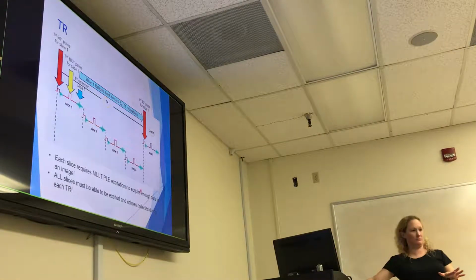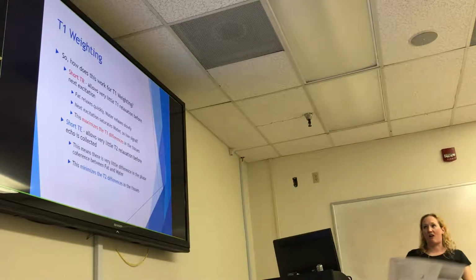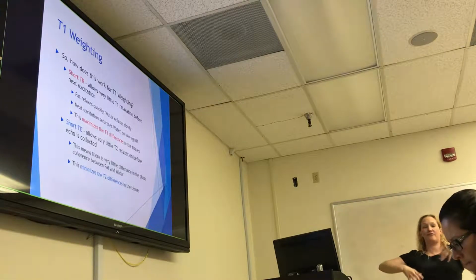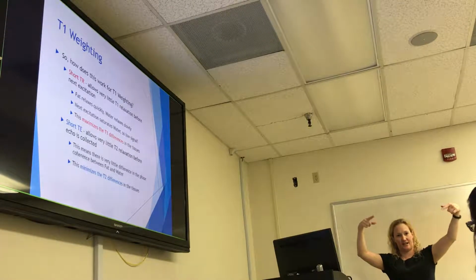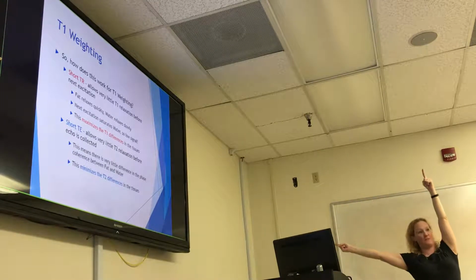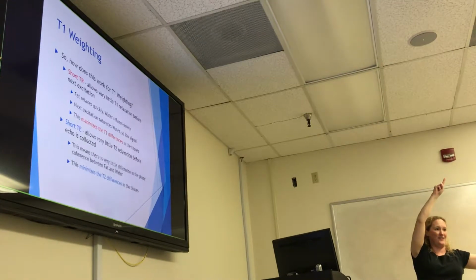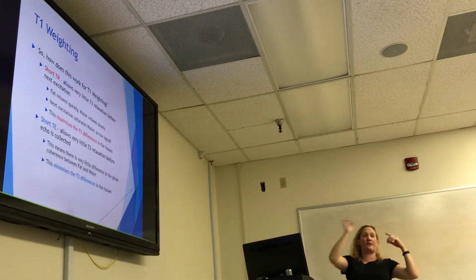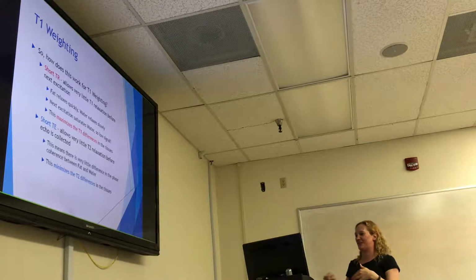With me so far? Okay, so let's talk about T1 weighting. So our short TR allows very little T1 relaxation to occur before we come back to that slice. So we want, next time we come back, to have a big difference so that when we flip it again, the fat is giving a signal, the water is not, for a T1.